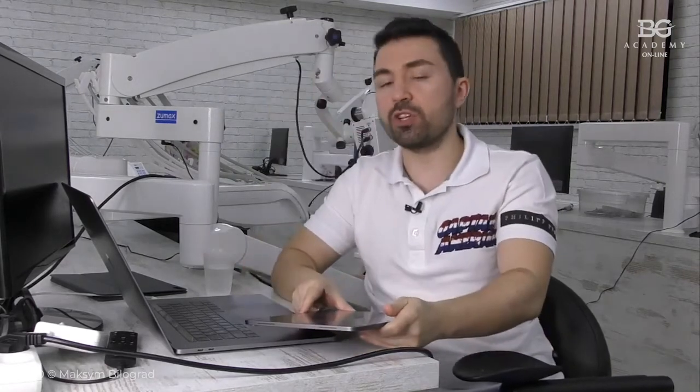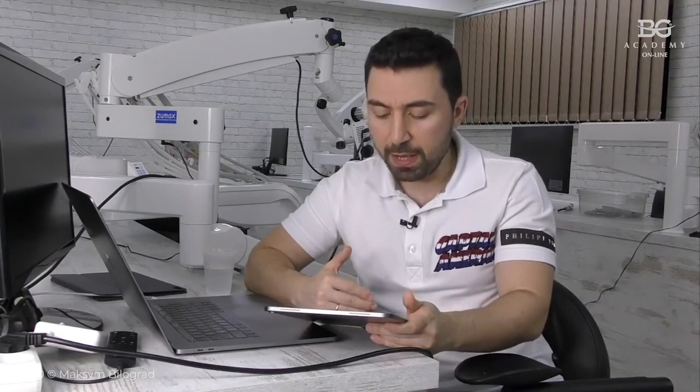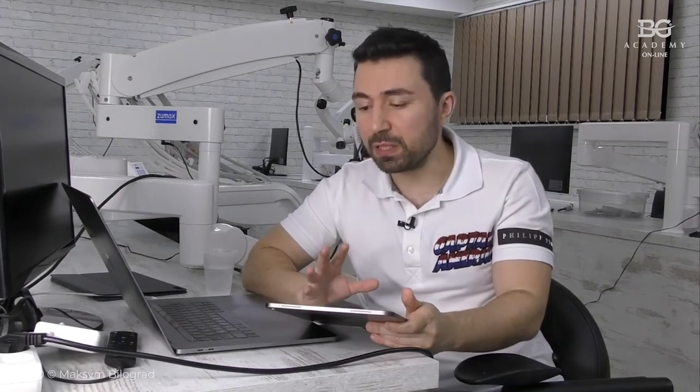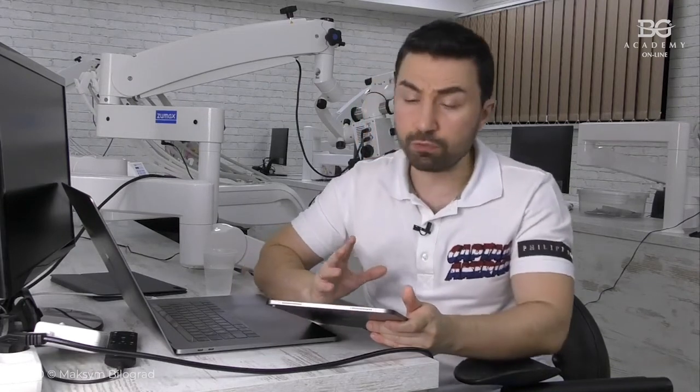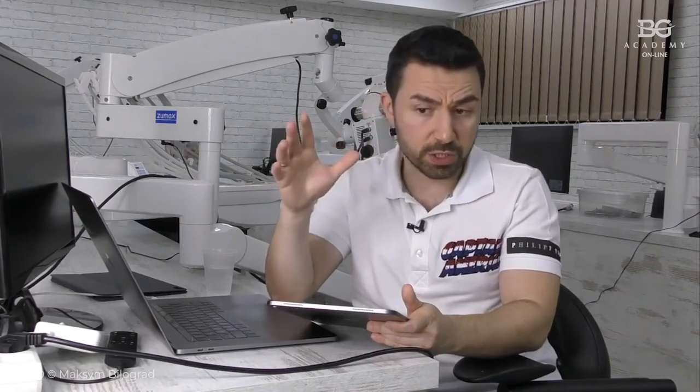Actually, yes, we have a sequence of instruments because every single procedure that we do has its own protocol. So every single step is predicted, and the assistant knows every single step. So we have organized every single instrument. My protocol that I showed you is a little bit complicated, but what is good about this protocol is that we can be really confident that we bond our veneer properly, and the fit of the veneer is also proper, and it sits in its own place.